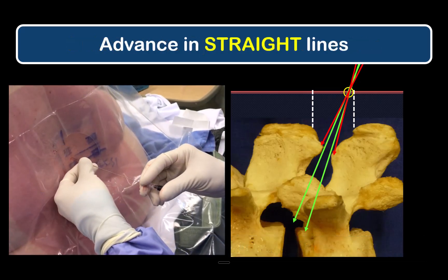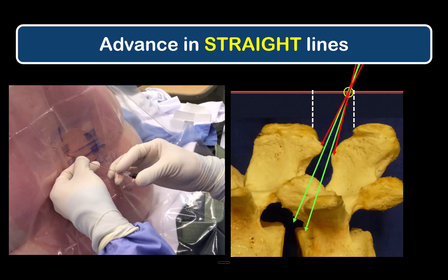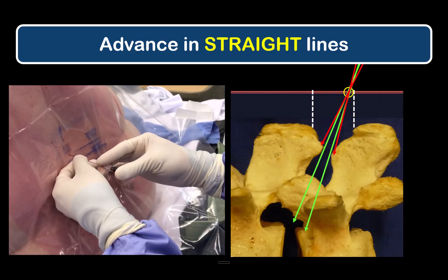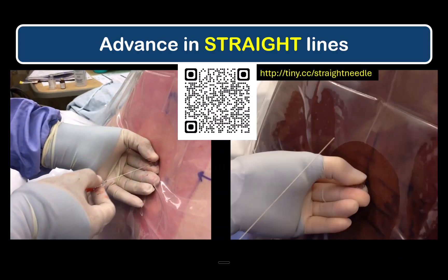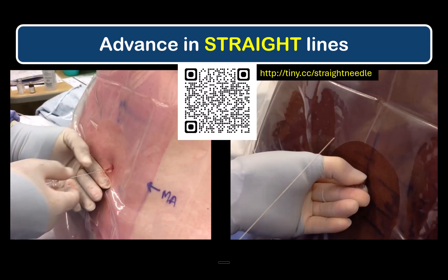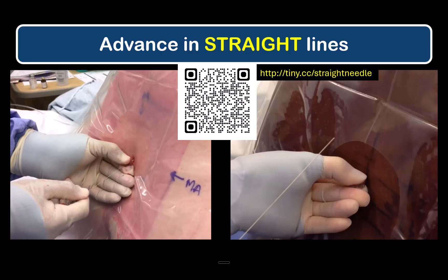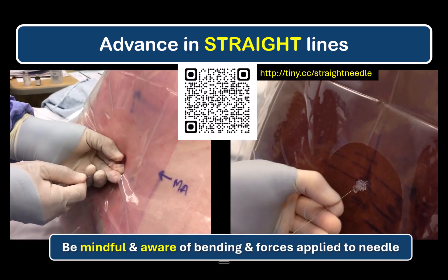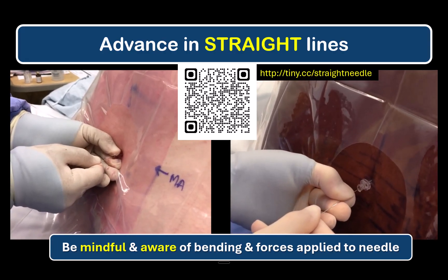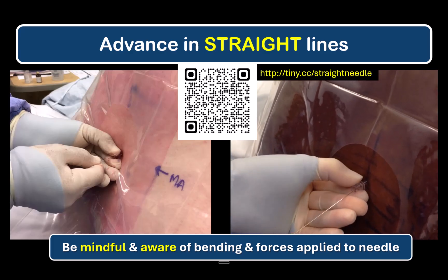The next point to be mindful of is to ensure that you're advancing in a straight line. Don't bend needles or let them deviate off course — it should be obvious why this is critical for accuracy in reaching the target we're aiming for. The key is to be aware that bending or deviation may be happening, particularly with the thinner, more flexible needles. If you're mindful, you can both see and feel the shaft bending, and then you should adjust your grip and force application accordingly. I often vary how I hold the needle depending on the type of needle I'm using, the position of the patient, and other circumstances.